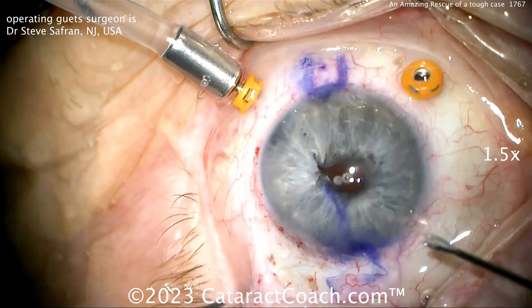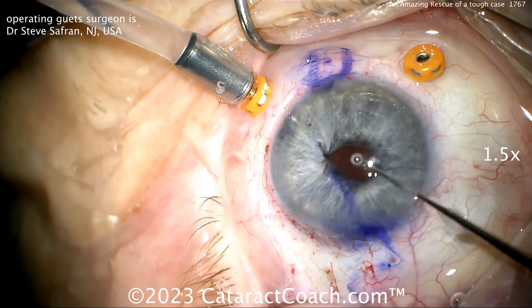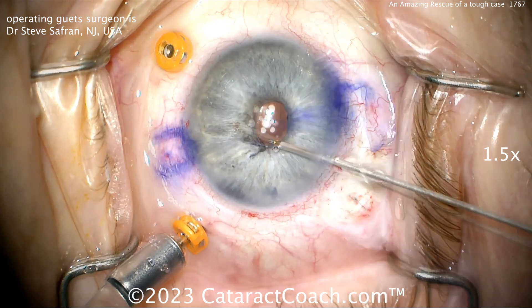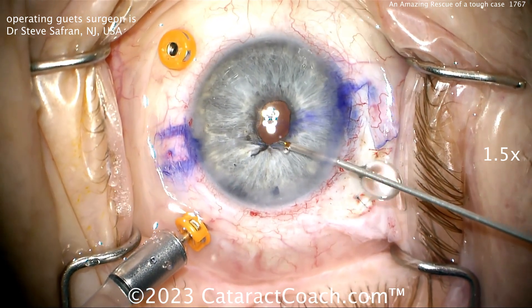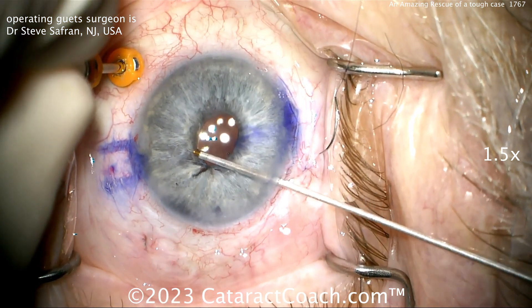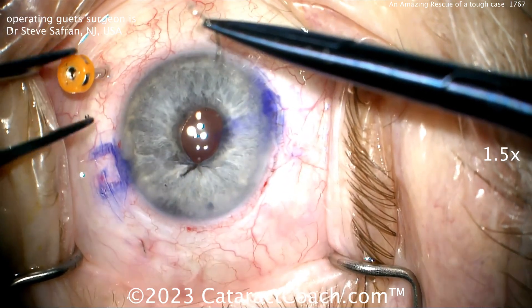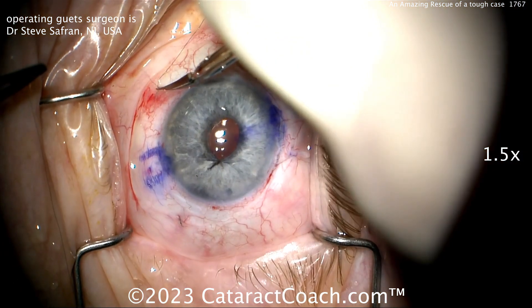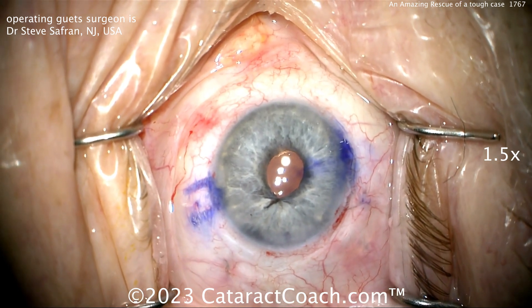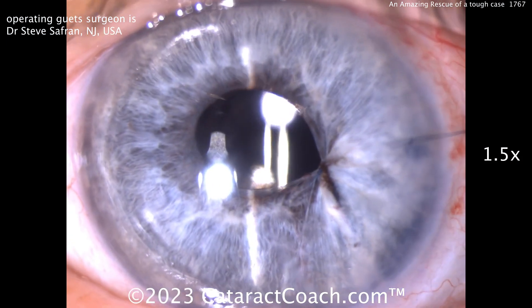Cutting those suture ends off, just examining what he's got going on. You can also further round the pupil by using a diathermy device — just do little micro bits of cauterization to get the pupil the way you want it. With a blue iris like this, it's obviously more visible. What a beautiful rescue for this case — what an artist. Dr. Saffron, thanks, always a pleasure to watch your incredibly tough cases. If you have an interesting case you want to submit, go to CataractCoach.com and click the link to submit your video. Beautiful result — post-op, fantastic work.